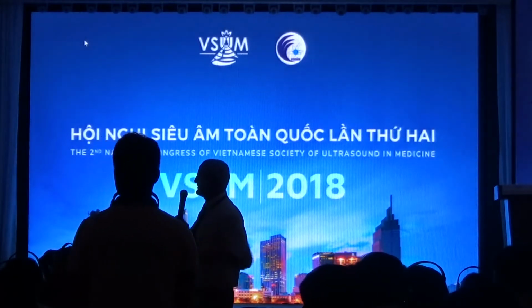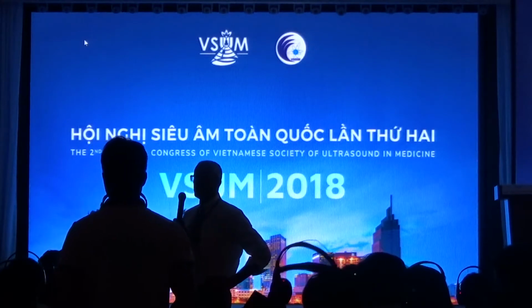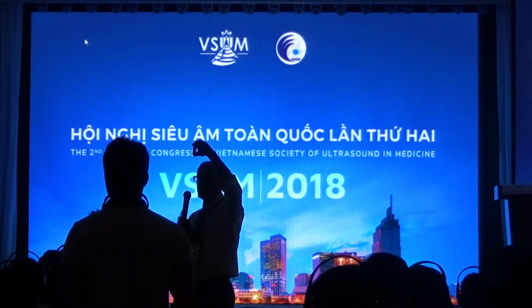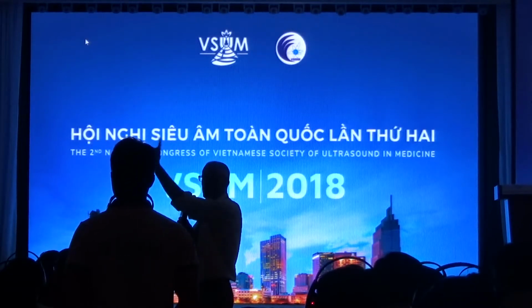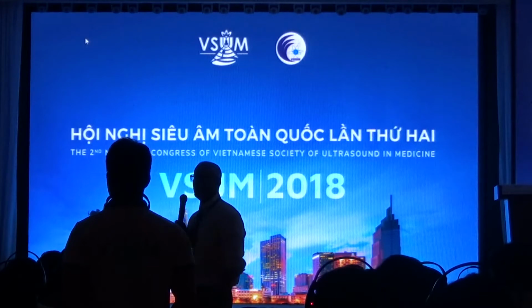There should be a standard report, and in the Siemens machine you have location number 1, you have focal lesion number 1, you have location number 2, number 3, number 4, number 5. You do 10 measurements and give that report.